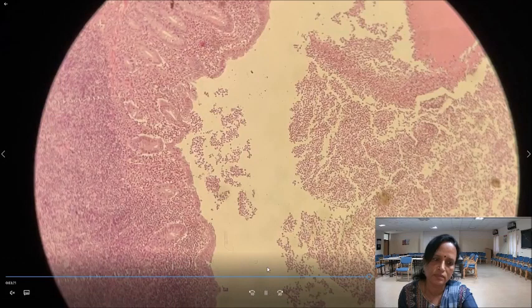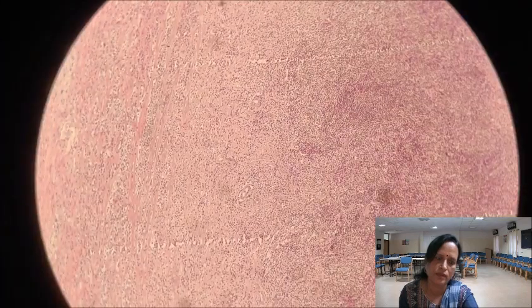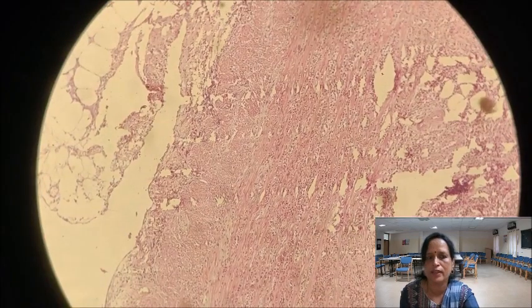Yeah, the entire lumen. So from lumen towards serosa we are going. Muscle, that is the serosa, and the fat. All the layers we have seen now. So there is transmural acute inflammatory cell infiltration, transmural neutrophilic infiltration, a very characteristic feature of acute appendicitis.